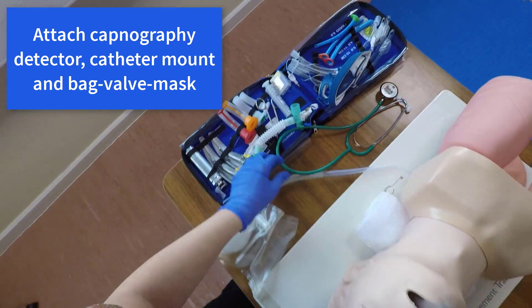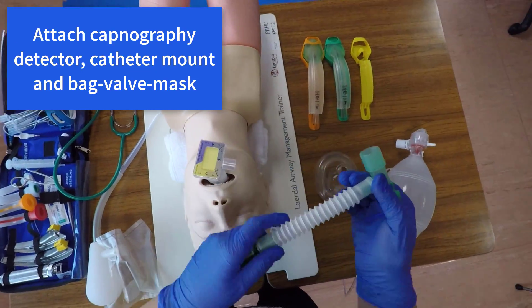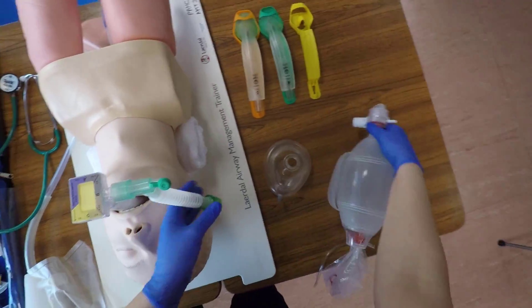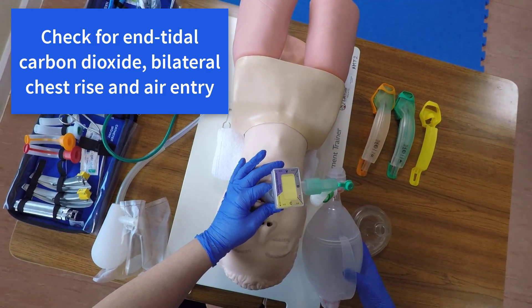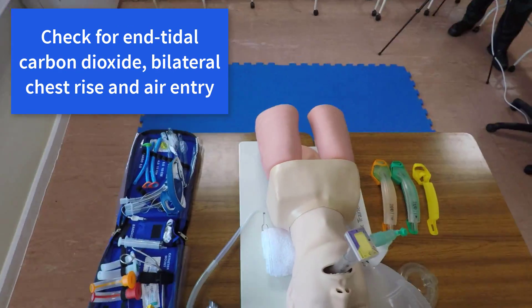The bite block should end up at the level of the incisors. Check for good chest rise, attach the capnography detector, the catheter mount, and the bag valve mask. Check for end-tidal carbon dioxide, bilateral chest rise, and good equal air entry.